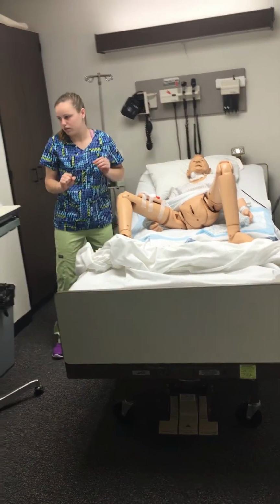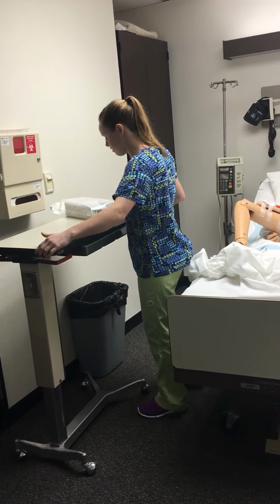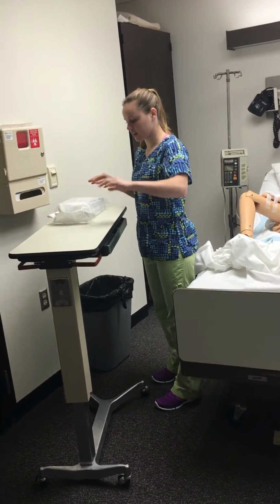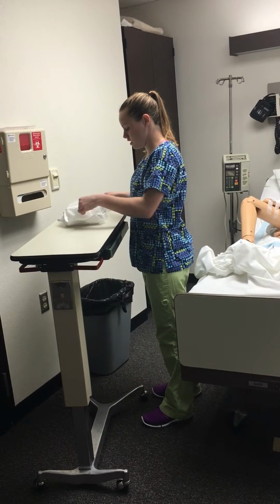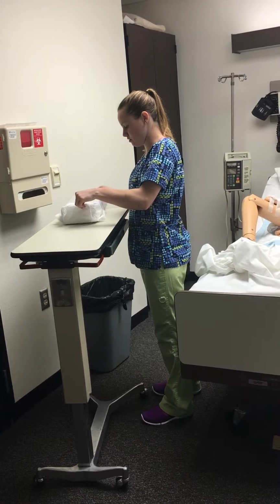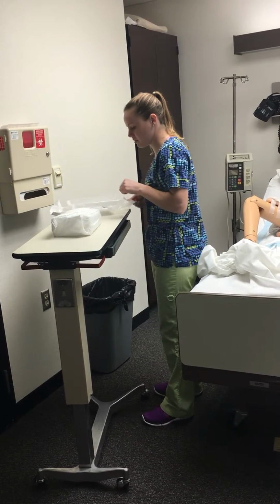Okay. So, now I'm going to open my skip kit and establish my sterile field. So this is a clean surface. My hands are already washed. I'm going to pull it out. Okay, this will be my garbage.